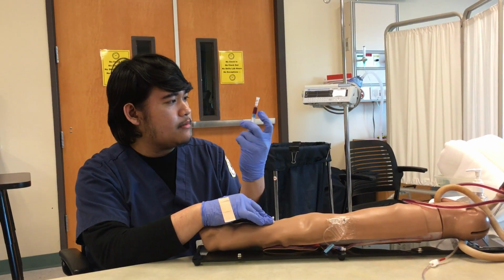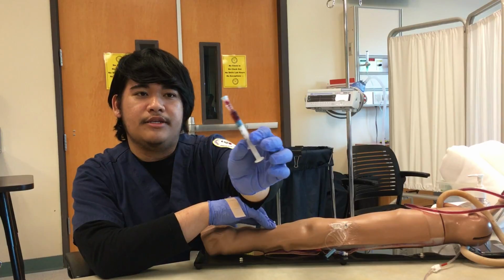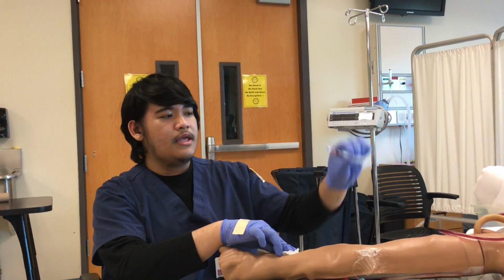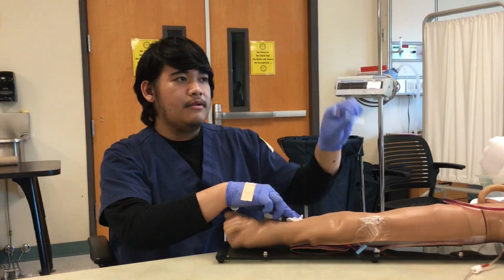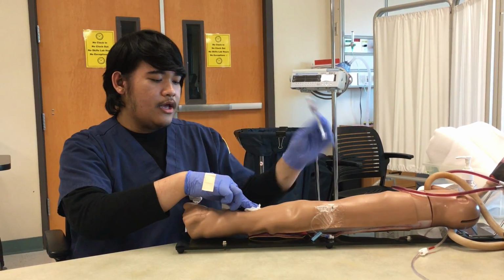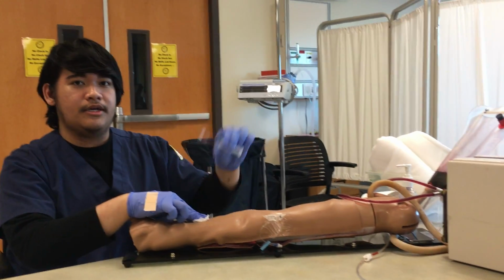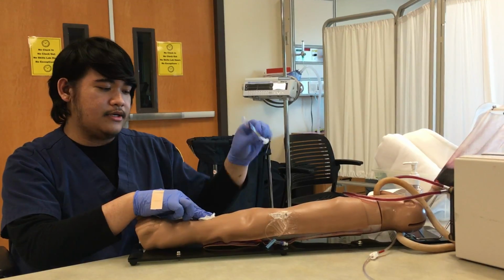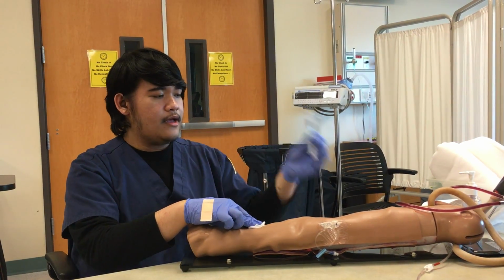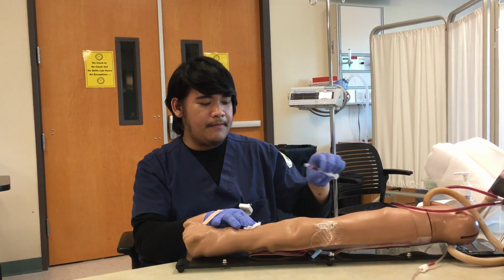Make sure that there's no air bubble in here, and then press up. Make sure that there's no air bubble in there, and start doing the figure 8 motion. Make sure that you don't touch where the blood is, because our body heat could interact with the blood and could cause something in the blood.